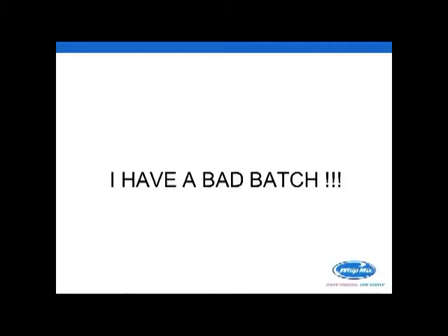Now, we get the phone call, I have a bad batch all the time. Batches are created generally in about 1,200 pounds worth of material at a time. And so your one little box, although it could be a bad box, generally speaking, is not a bad batch. What we need to do, though, is find out how to solve the problem that you have.